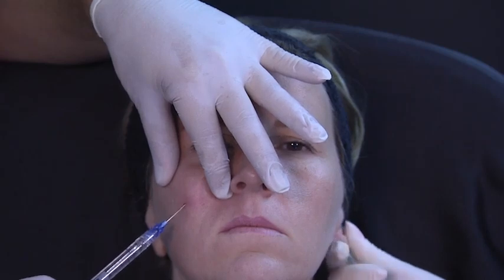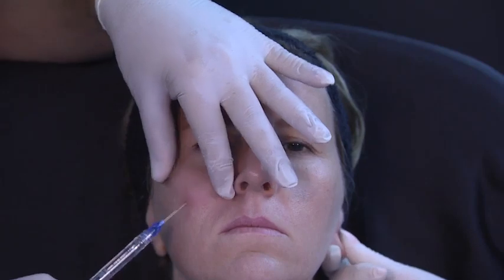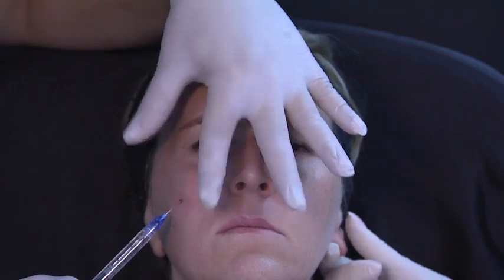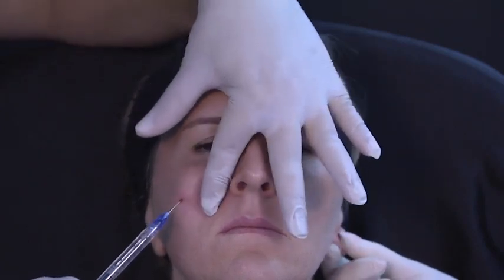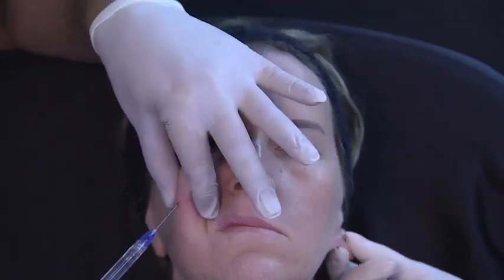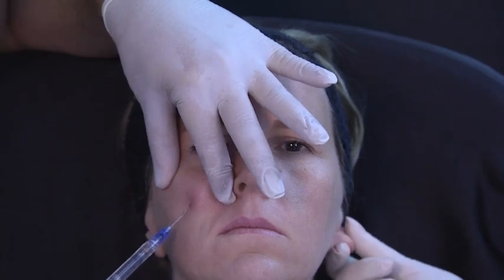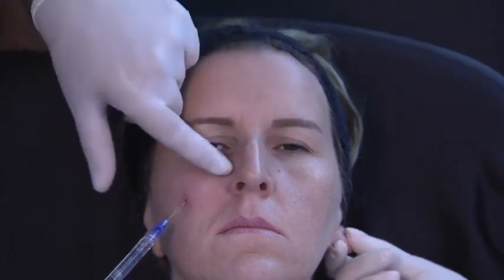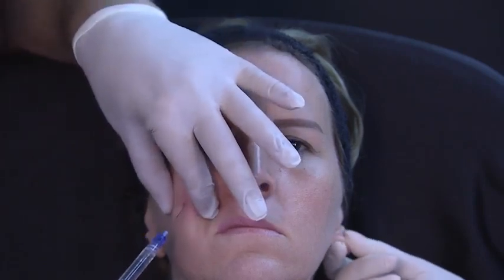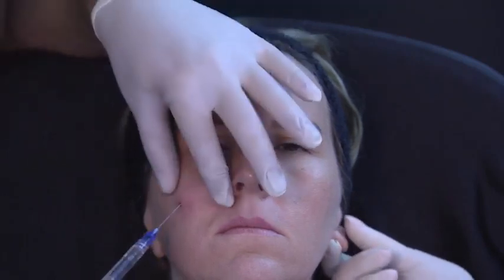Once I've done a 0.3 bolus, which I'm now reaching, I always put my finger to protect the area where I don't want the product to go, which is this finger here, avoiding any product spreading into the nasolabial fold. Now I pinch the skin and do a little bit of linear threading. All my product is in the deep plane. And now, because I want to volumize this area, I can do a fan technique with linear threading, towards the more lateral point, towards the zygoma.